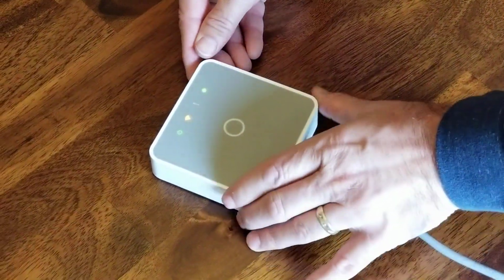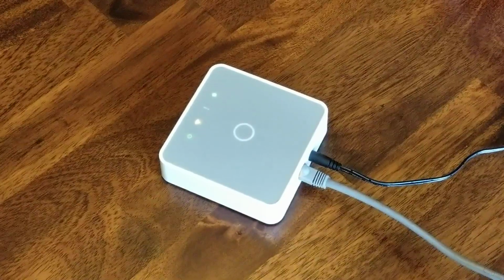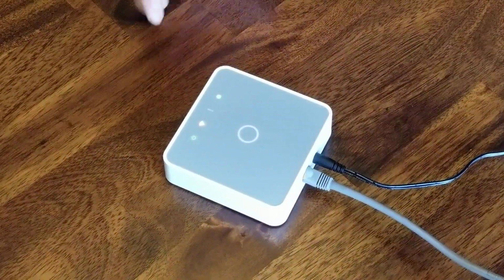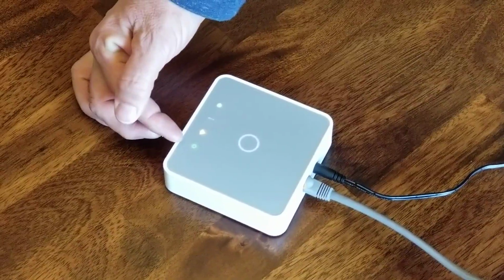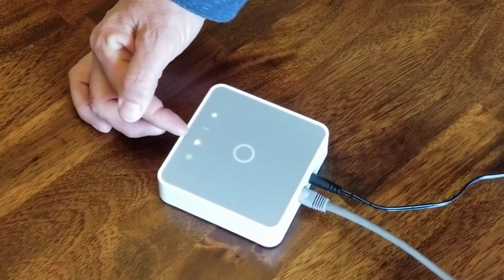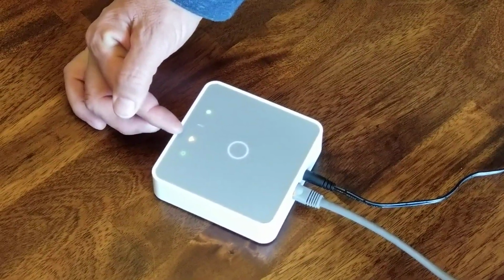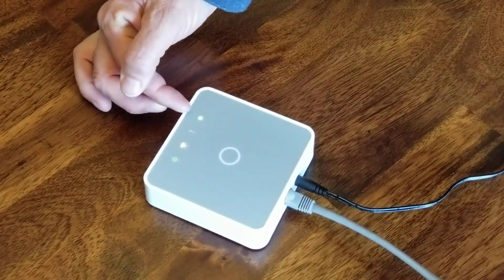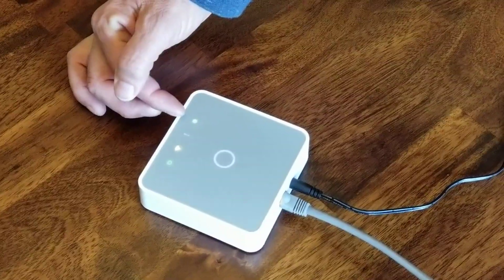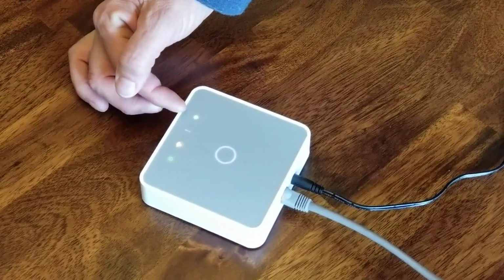You will know that your MyNotify hub and wearable device is connected by looking at the lights on the hub. The green power light will remain illuminated. The amber internet light will remain illuminated. The green connectivity light will blink constantly. This tells you that you are connected.